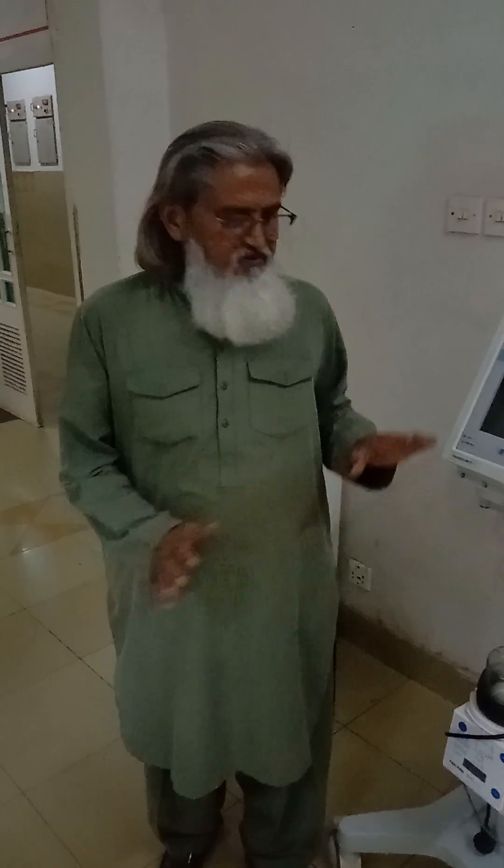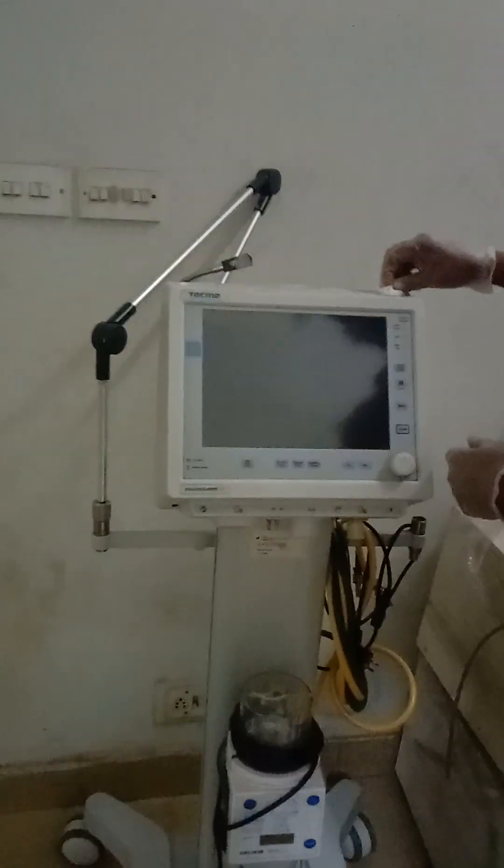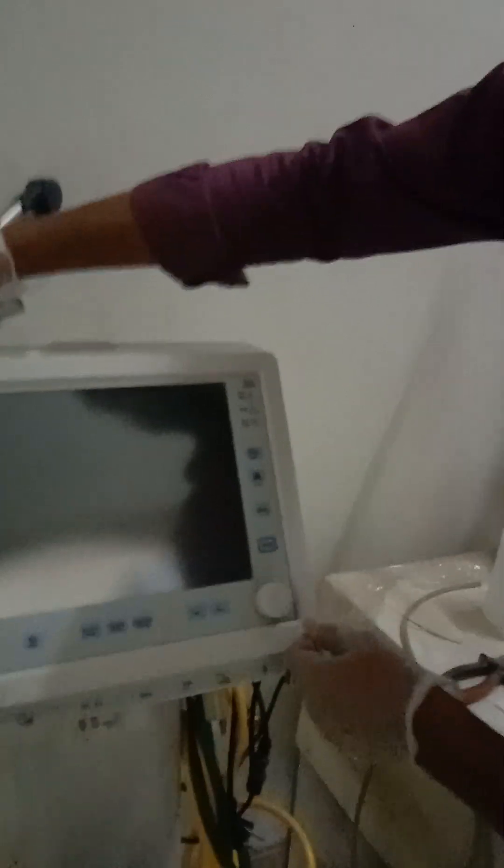Asalaamu alaikum, my name is Awan Dheem. Today we will tell you how to do the maintenance of the ventilator. How to do the maintenance of the internal service. In this session, we will tell you all the procedures. I hope that you will find this an informative video. We will tell you how to use the ventilator.